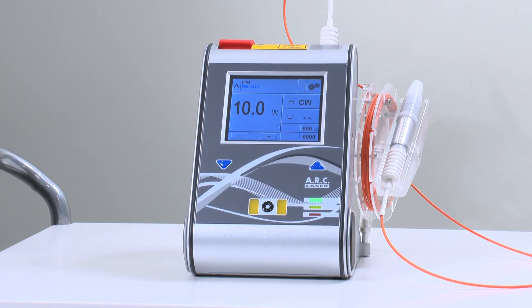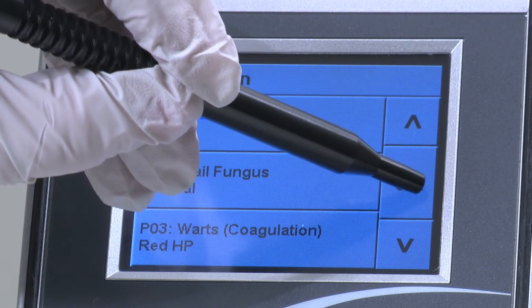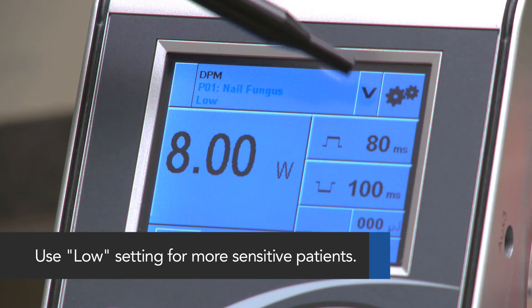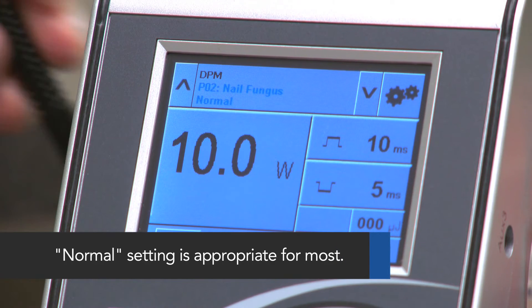Power the device on and ensure the proper setting. Select either nail fungus low or nail fungus normal. Use the low setting for more sensitive patients. For most patients, the normal setting is appropriate.